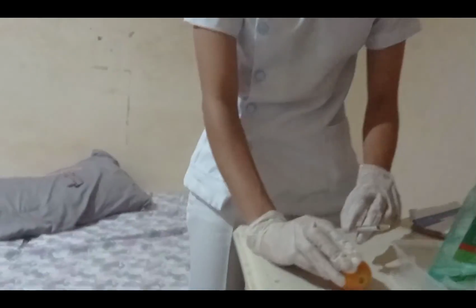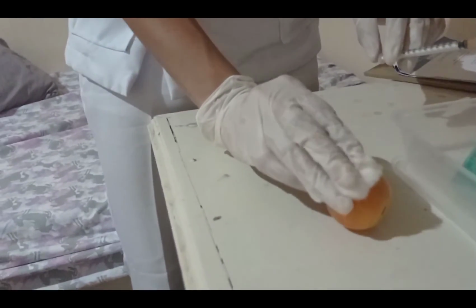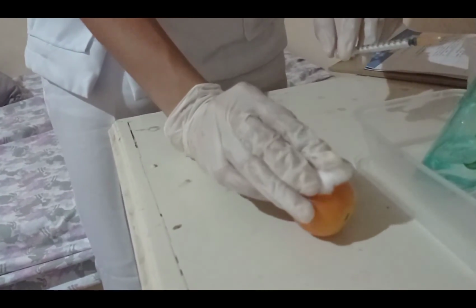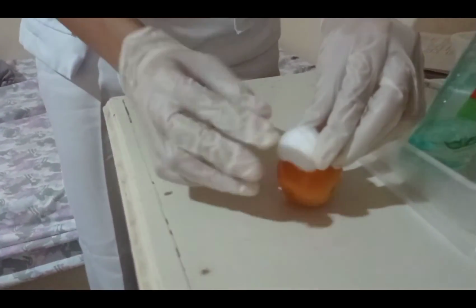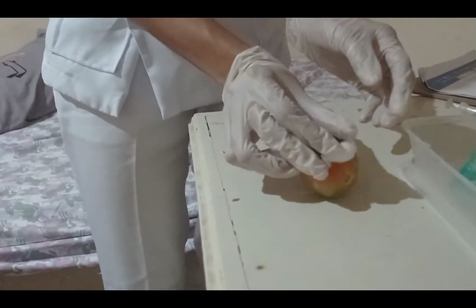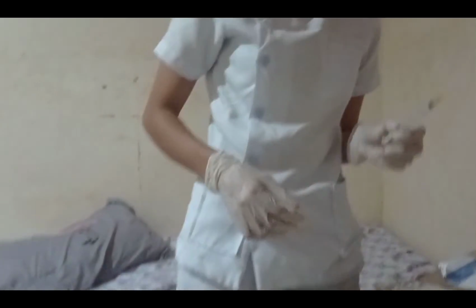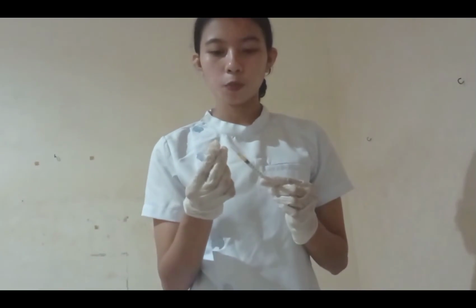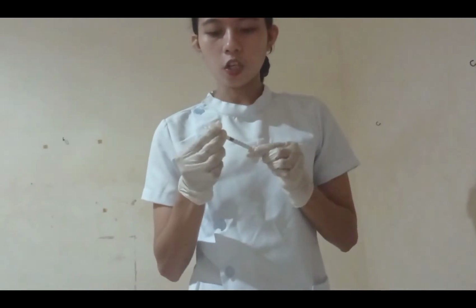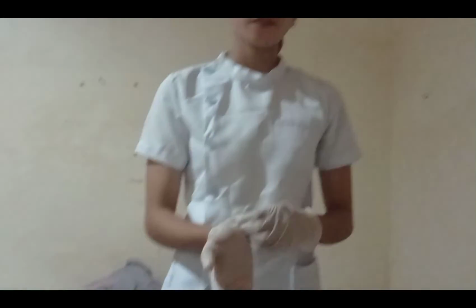Then the next is to cover the injection site with sterile gauze or cotton balls, using gentle pressure, and apply a band-aid as required. Then place the safety shield on the needle and discard the syringe in the appropriate bin. First put the cap before discarding it. Discard all other supplies used and the gloves that we used.